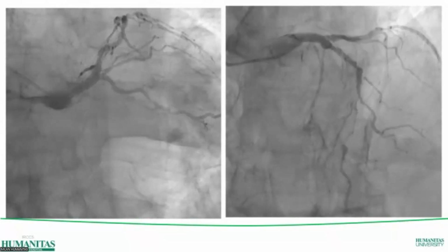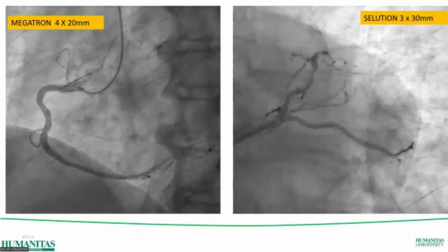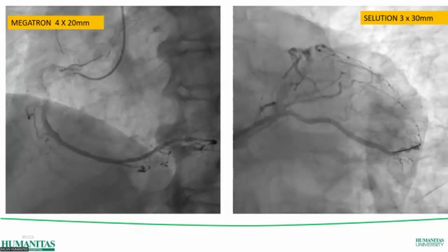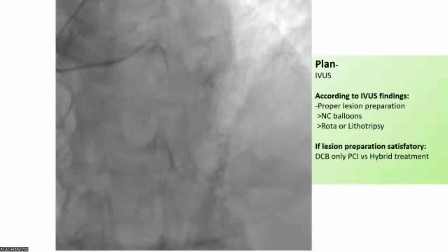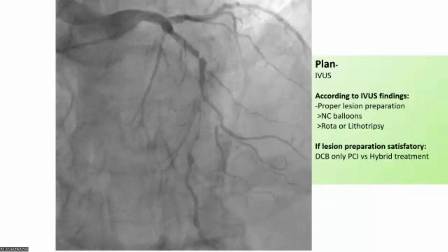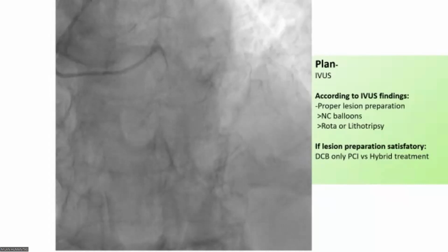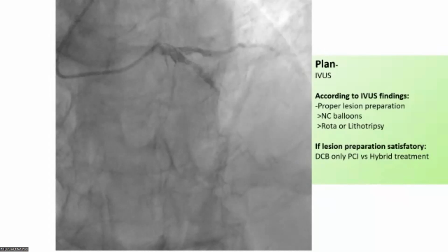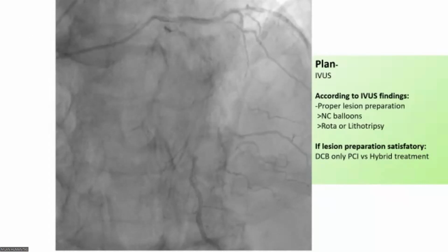Next, we have stented the RCA and have done the POBA with DCB to the OM, 2 months back. Now, next, this is our plan to intervene in this LAD. Our plan is to do LAD intervention with the IVUS. If IVUS doesn't cross, then we'll do the POBA first, then we'll decide further. That's all from my side.